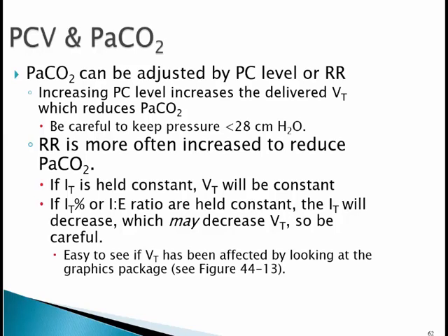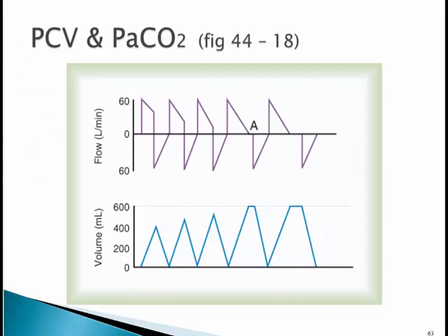Easy to see if the tidal volume has been affected by looking at the graphics package. This is figure 44-18 on page 1125. This is the effects of inspiratory time and inspiratory plateau on a delivered tidal volume in the pressure control mode. Initially, as inspiratory time is increased, tidal volume increases. When an inspiratory plateau is achieved, a further increase in inspiratory time does not result in increased tidal volume.